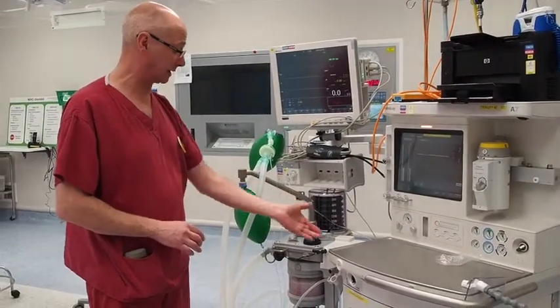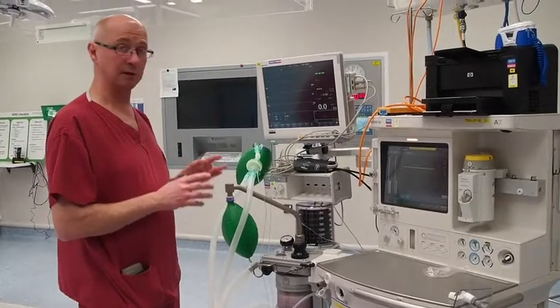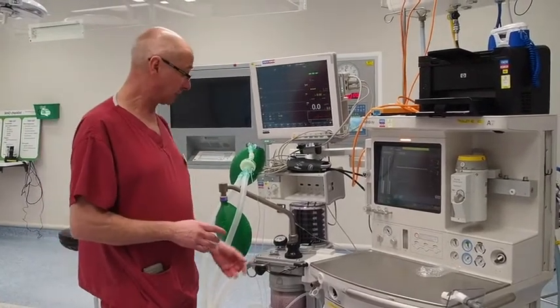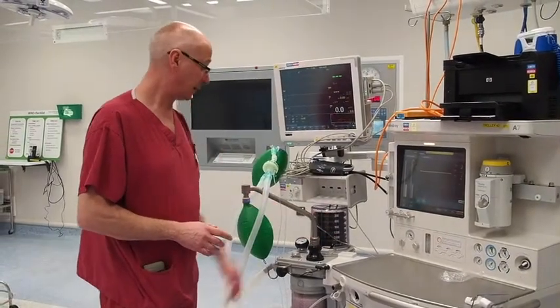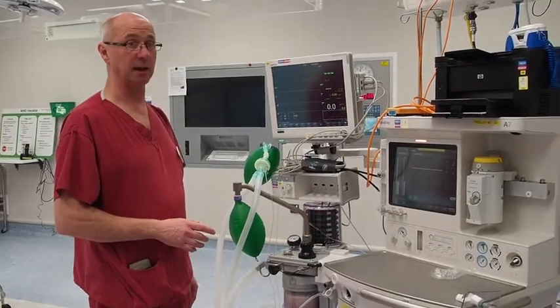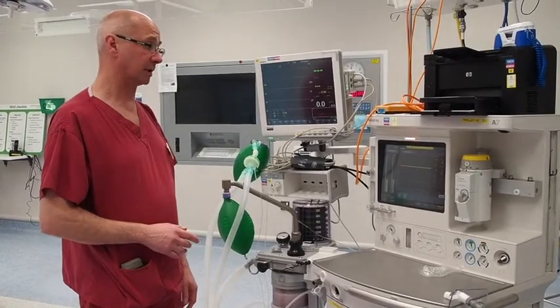If the bellows collapse, give an oxygen flush, and effectively treat it the same. And it is quite nice if you want to do some bagging with the patient, as you just flip onto the manual setting without having to disconnect the patient. And that makes it probably a bit safer for COVID actually.